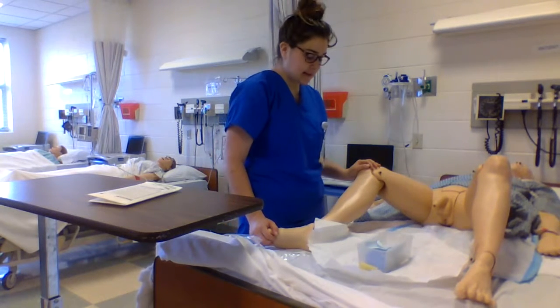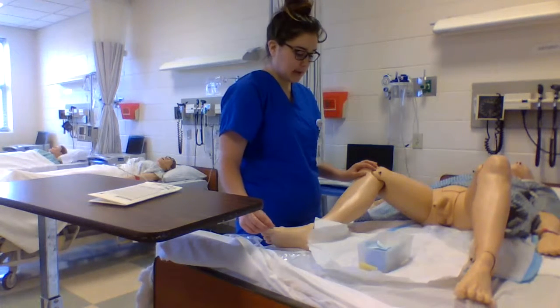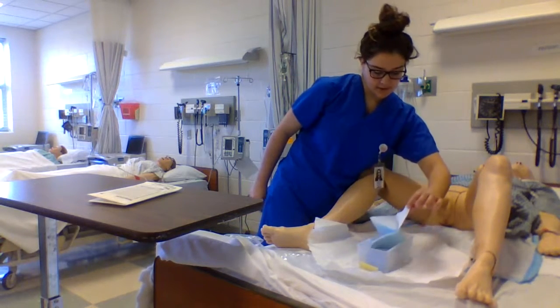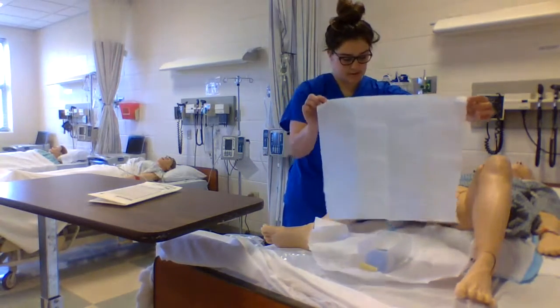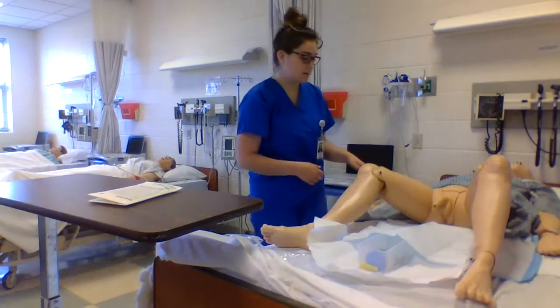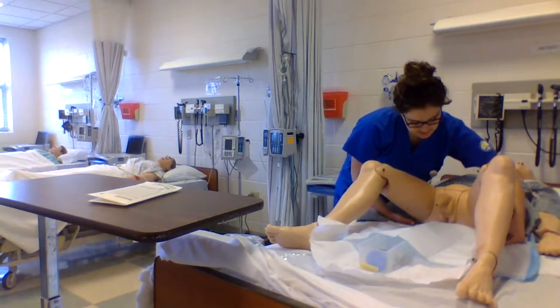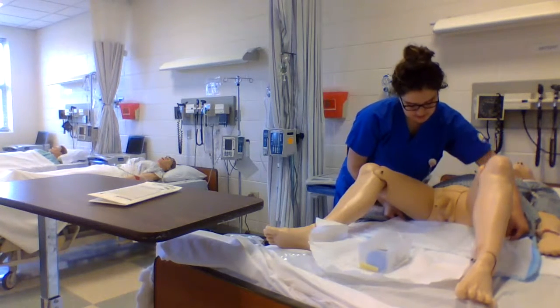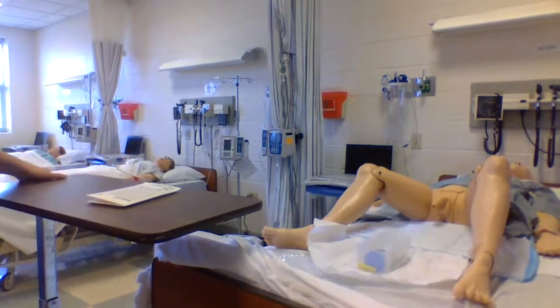And so now I'm going to get my blue pad. I'm going to come in the least invasive way, which I believe would be this way this time. So I'm going to come around him, reach around and come below him. If the patient was able to raise his butt up, I would ask, Mr. Jones, can you raise your butt up? But since he can't, I'm going to help him. So I'm going to raise his butt up and assist him with adjusting the blue pad where it needs to be. I'm going to bring you guys closer so you can see a little bit better.